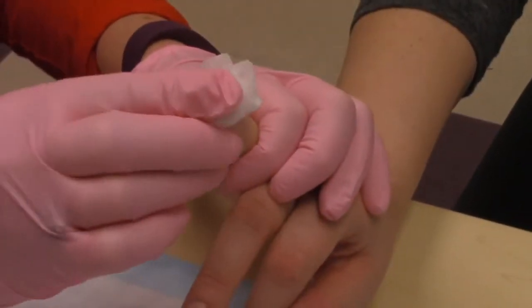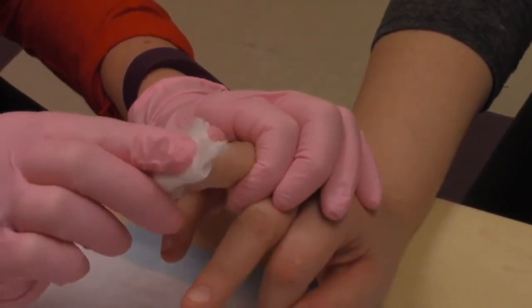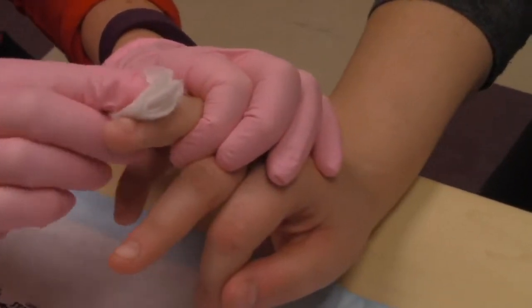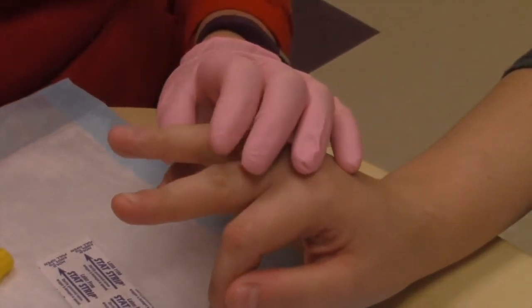Please keep in mind that some children will bleed from the finger poke very quickly so it may get a bit messy. We have included the absorbent pad and gauze to help keep the process as clean as possible.